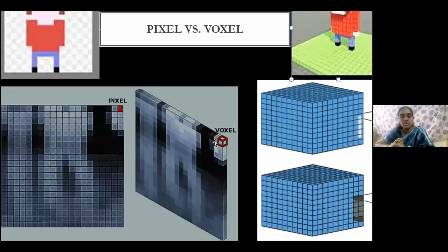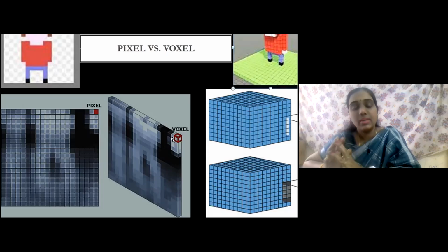This is a very important point, because in CBCT all the voxels are isotropic, which is a great advantage because it gives the best spatial resolution, where you can make real-time measurements or imaging. You can exactly measure the size of the tooth, the size of a root canal, the size of the available bone present for implantology. All these things we are able to do because the voxels in CBCT are isotropic.